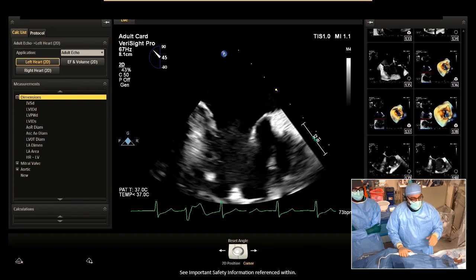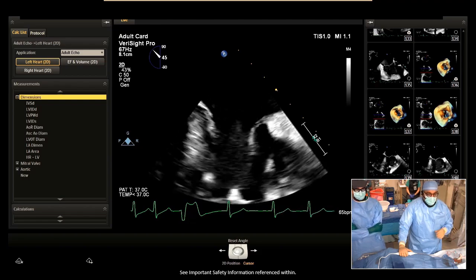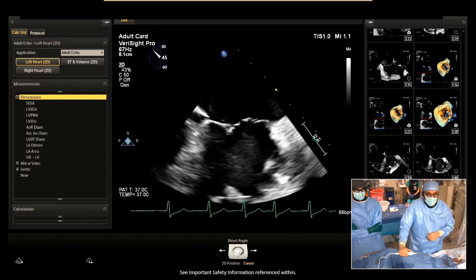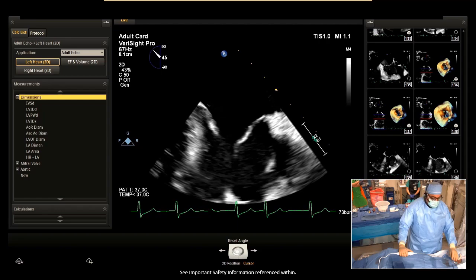And I think what we're going to do, Edris, is I think given the central nature of the TR, we'll start off with an XTW and we'll go AS mid to central and see what the TR looks like. And if it looks like we've abolished most of that central TR, then I think we're going to stop at one clip. And then if we need to put one in SP, then we do that. How does that sound to you?